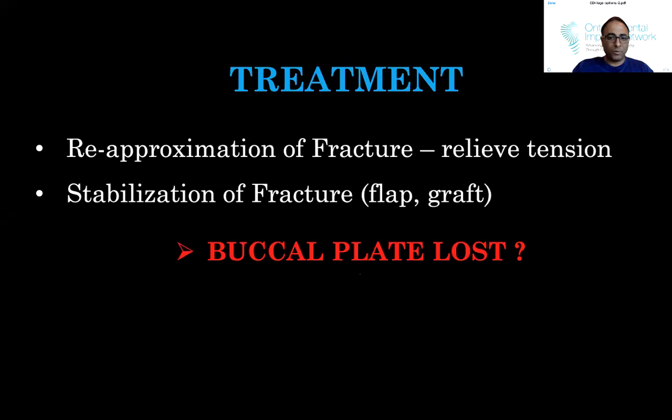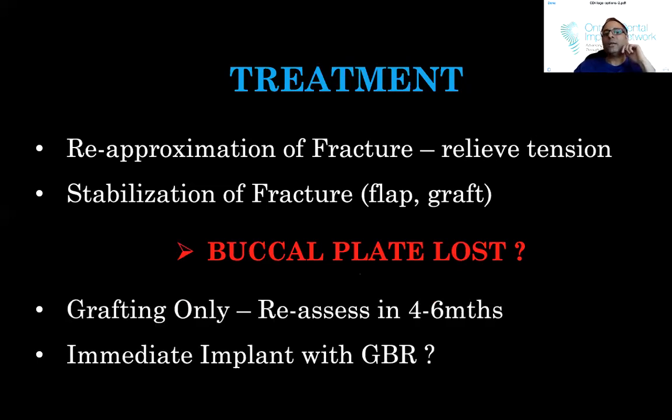But if you lose the buccal plate, what do you do? Like, the buccal plate is gone, right? So at this point, you're grafting only for most of you, okay? And then come back and fight another day, right? Reassess in the CT. And again, your GBR should include a membrane.